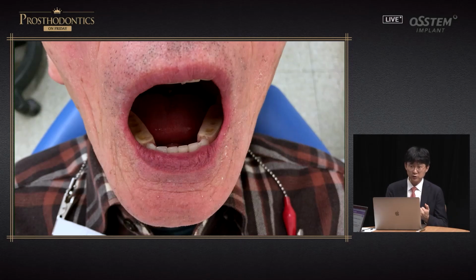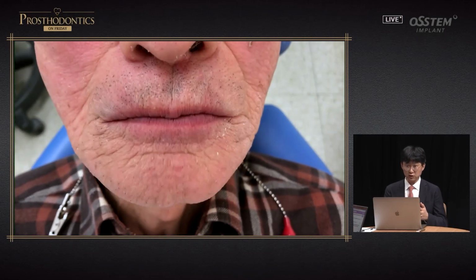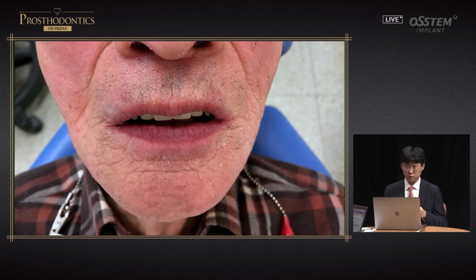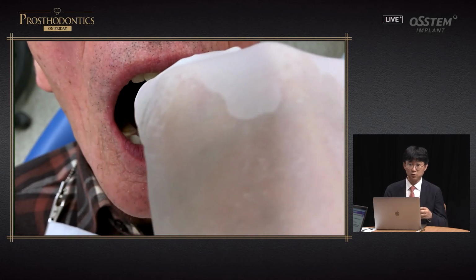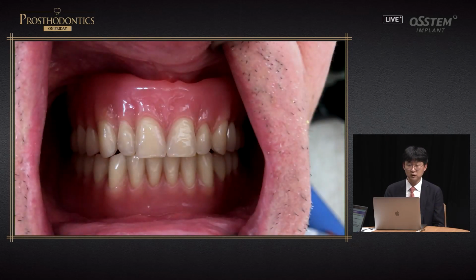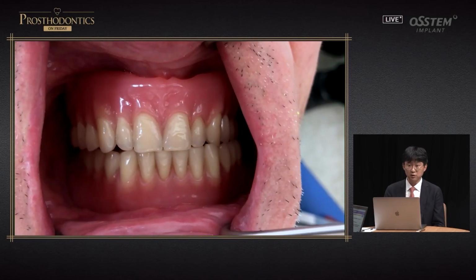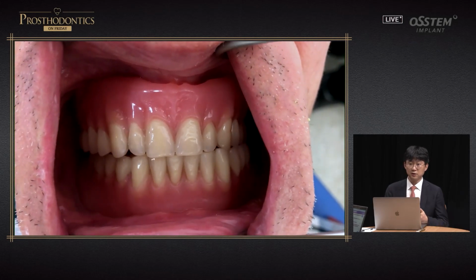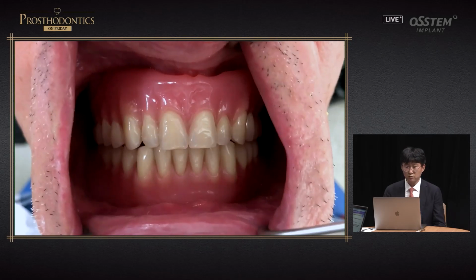The patient's slight forward chewing position is improved, and after about a month, the occlusal surface is worn down, and you can see the position where the patient is chewing repeatedly. So it has some retentive force, hardly with any ridge. For patients with a severely resorbed ridge, lingualized occlusion is provided. It has been 4 years and the patient still uses the denture pretty well.